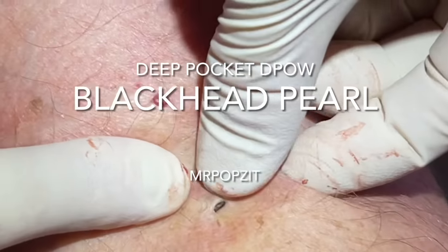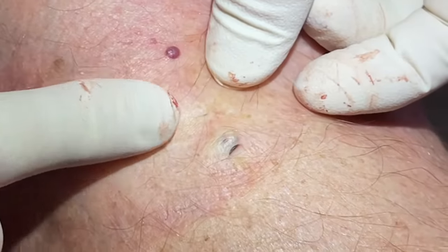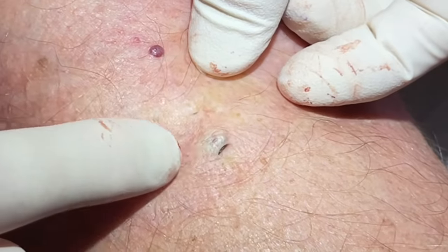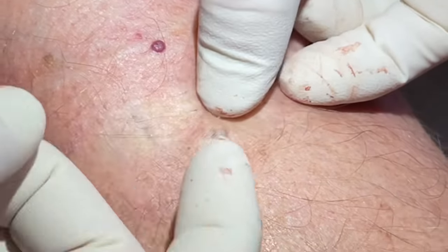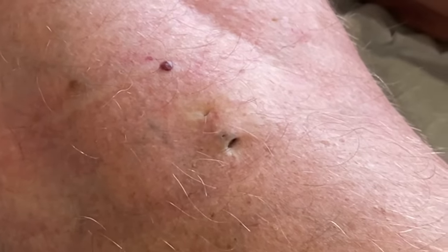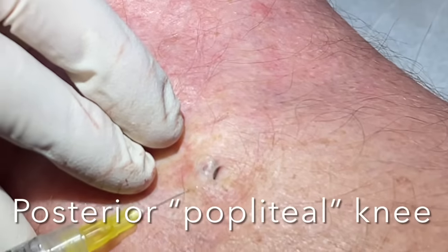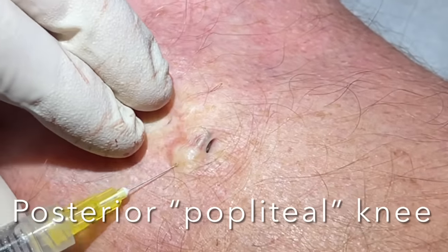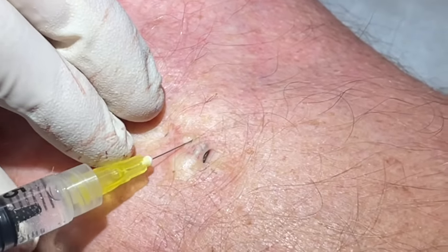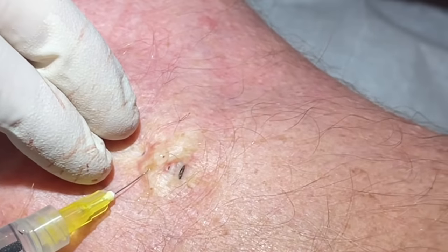You can see here we have a large blackhead right behind the knee, kind of tucked in there like a little pebble. We're going to do just a little tiny bit of light there, and then make a little cut on that surface of the skin. This will pop out like a little pebble — there we go. A little pinch — sorry, that's a sensitive area, I know.